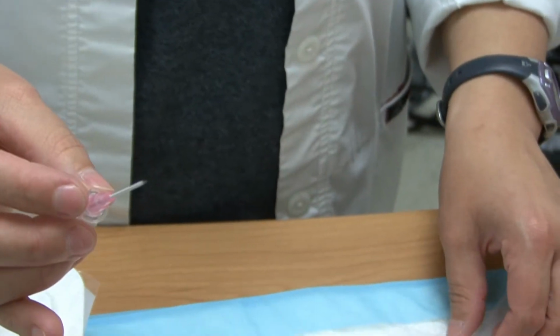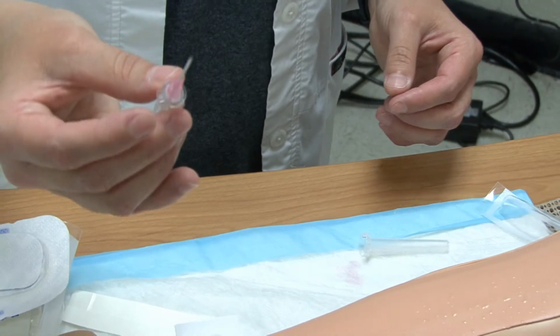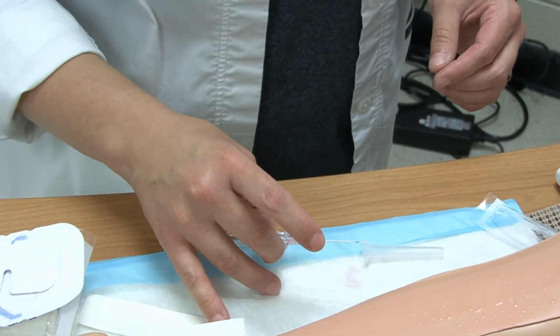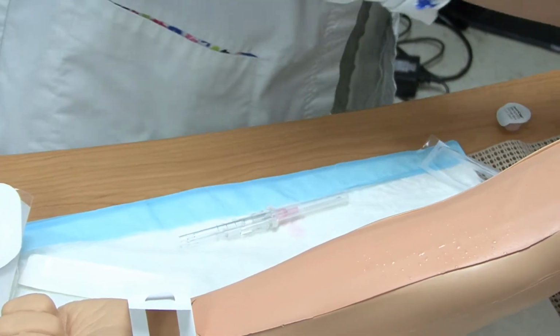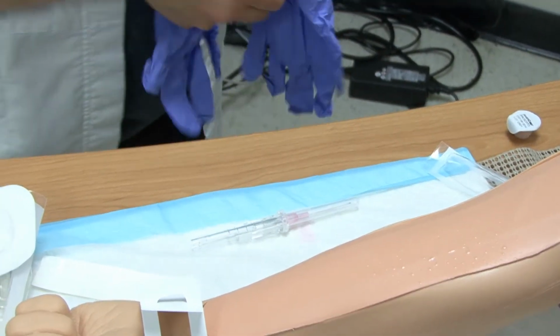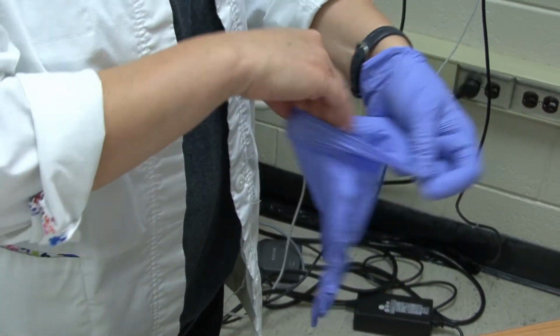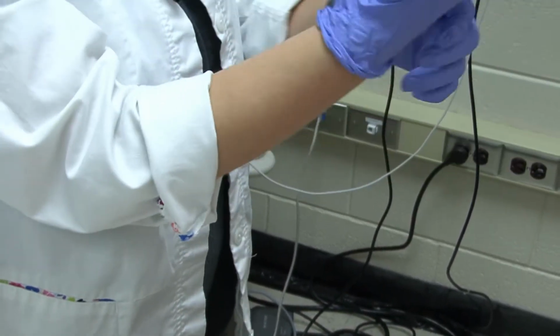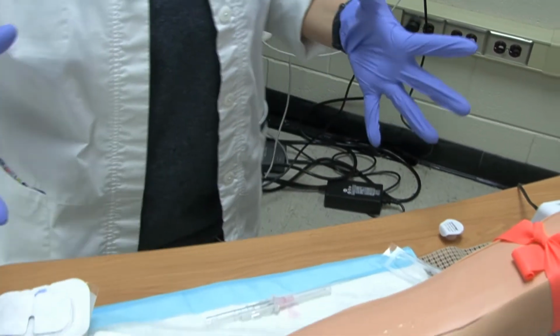Now that I have assessed this, it looks like it is clean, dry, and intact. I need to put the lid back on it, so you need to use the one-handed capping method. Once I've got it in there, I can recap it, because I must put my gloves on before I do the insertion. So I'm going to come back over here and put my gloves on. The gloves are not necessary for the cleaning, but you must have them on for the actual insertion.